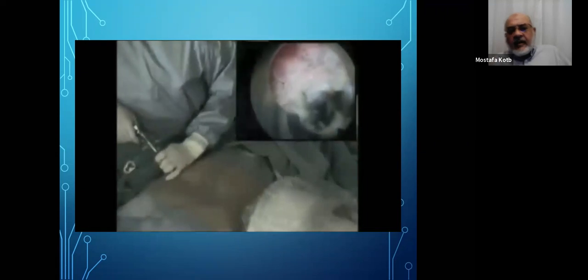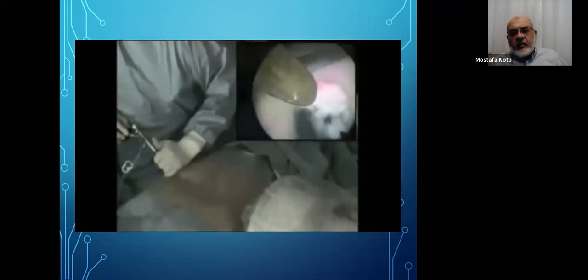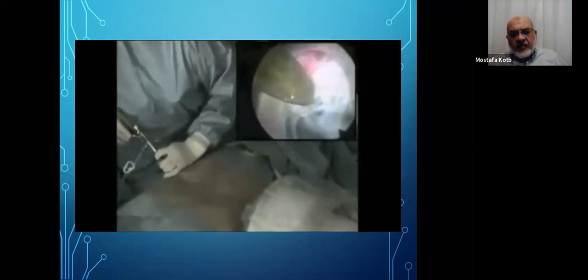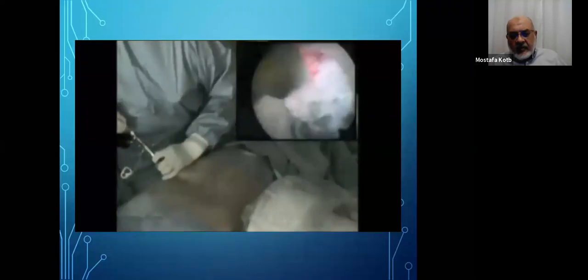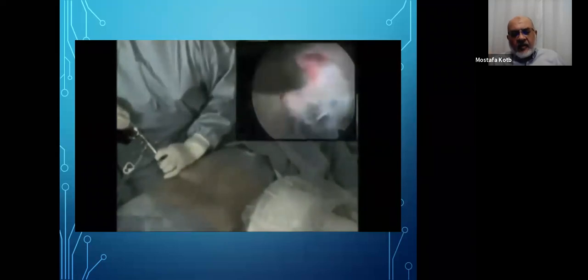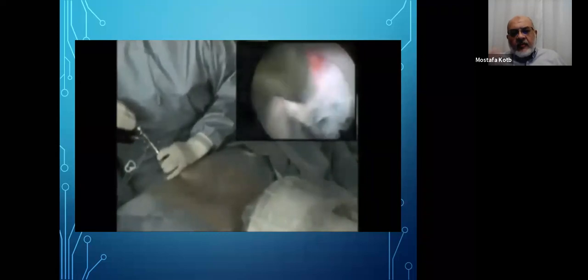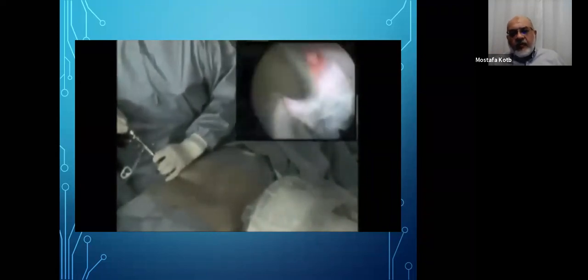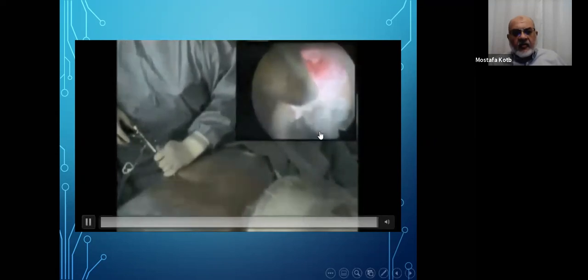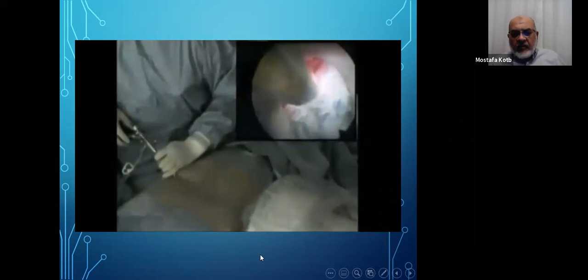The idea of this approach by that time was to reduce the intradiscal pressure and thus retract the annulus from its pressure on the nerve roots and the theca. You go on with removal of the disc material under endoscopic guidance, as you can see, until you deem that you have removed enough disc material from the disc.